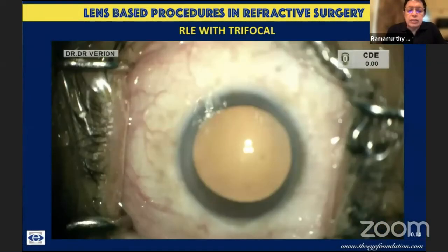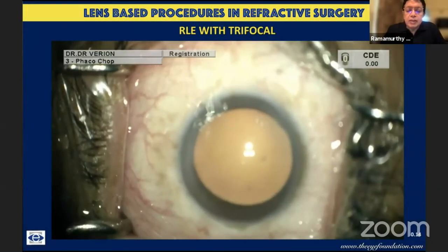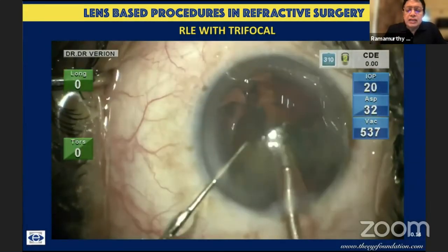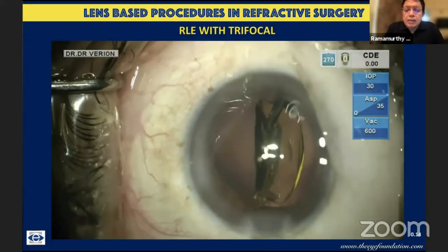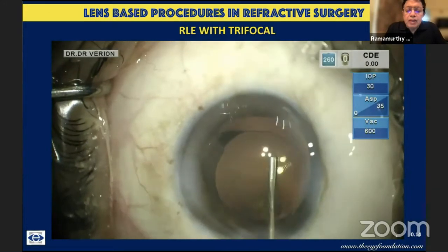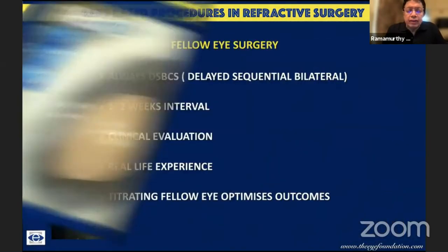If you're doing your surgery without the use of the laser, again, it's extremely possible. In these cases, I use a fairly high vacuum, keep it at around 600, keep the intraocular pressure at 20, virtually phaco aspirate the lens, and then subsequently implant the lens of my choice, which is more often the trifocal lens in these cases today.